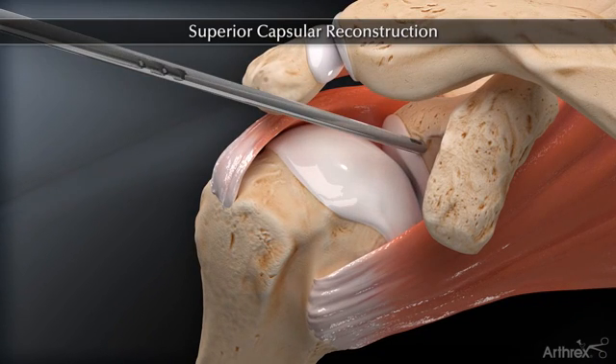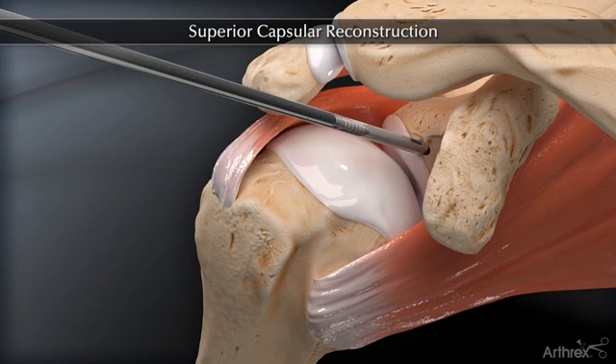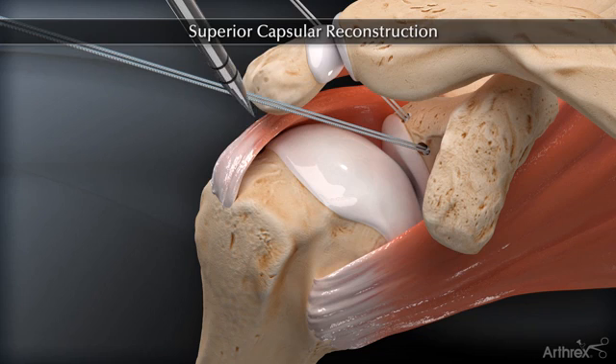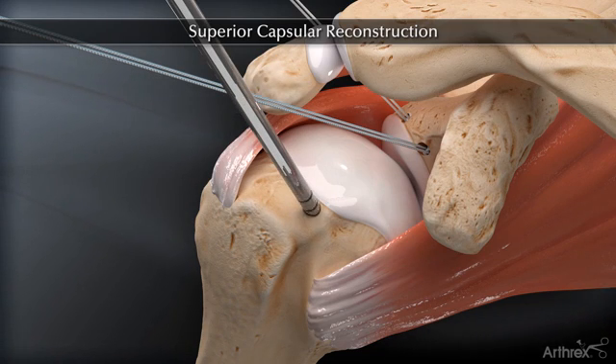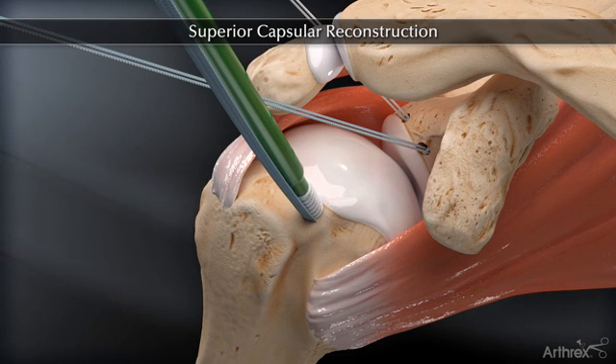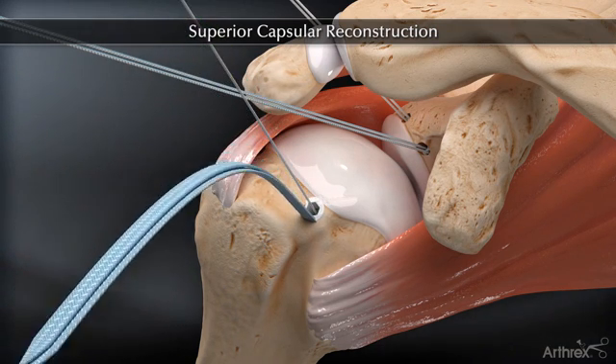The superior glenoid and humeral tuberosity bone beds are prepared, and two 3 mm biocomposite suture tack anchors are inserted percutaneously into the superior glenoid just medial to the superior labrum, and two biocomposite swivel lock anchors preloaded with fiber tape are inserted into the greater tuberosity spanning the defect.